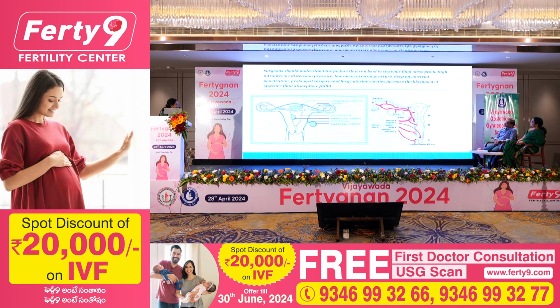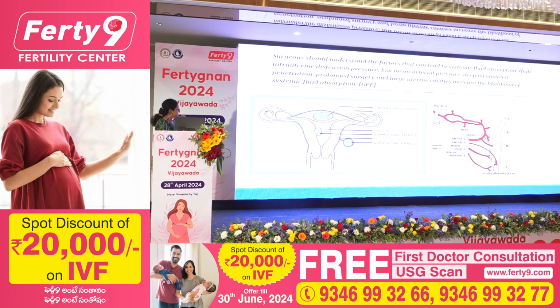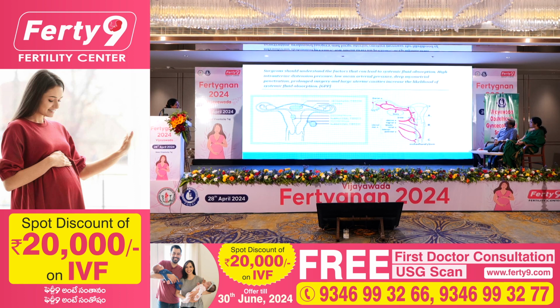This is a very good pictorial representation of how to go about and how the damage occurs in a case of resection of submucosal fibroid. As we can see here, the overlying endometrium on the submucosal fibroid, once you start resecting, you will be resecting the endometrium, then the submucosal fibroid per se, and almost when it is invading the myometrium to less than 50% is the stage when you can do a submucosal resection of the fibroid. Beyond that, you should not do it hysteroscopically. Surgeon should understand the factors that can lead to a systemic fluid absorption. Means this case selection is most important in such cases.